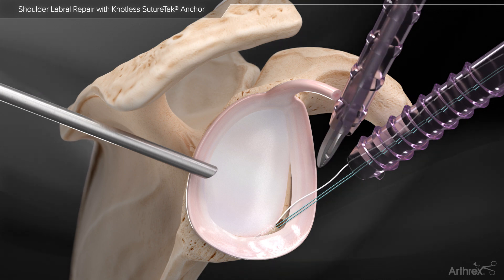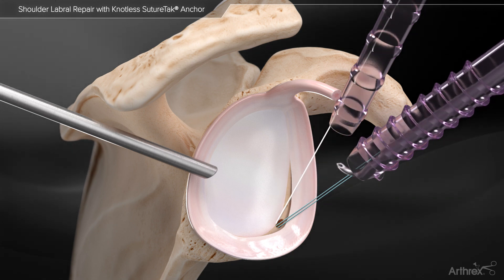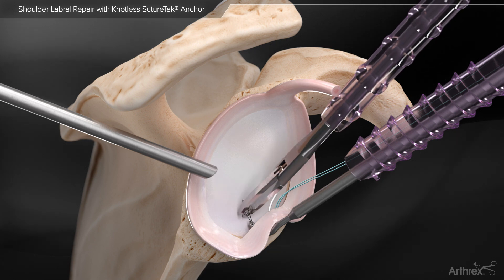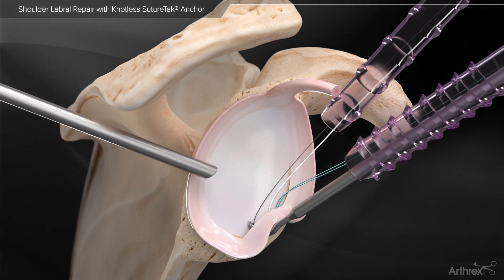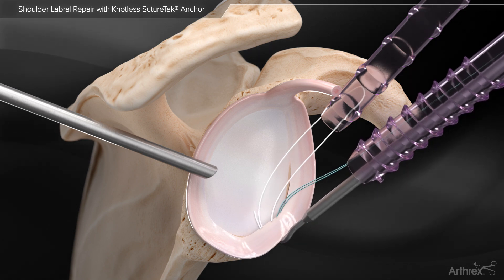The FiberWire suture is retrieved out of the anterior superior portal with a suture retriever. The suture is passed through the labrum using a quick pass suture lasso. The wire is retrieved, the suture is inserted into the loop, and the wire and suture are retracted back to the lasso tip and then shuttled through the tissue.